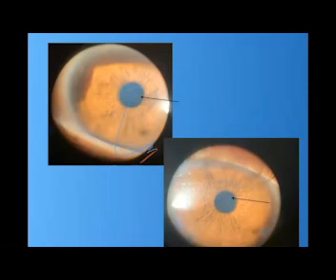This patient's age is 45, with stable refraction and good best corrected visual acuity, and with these faint opacities in the cornea, which helps you accept the irregularity of the corneal surface and the steep points, which are beyond normal. So you can go for refractive surgery because all the irregularities are explained.